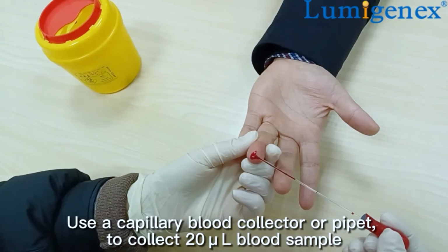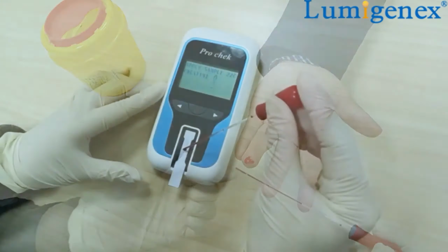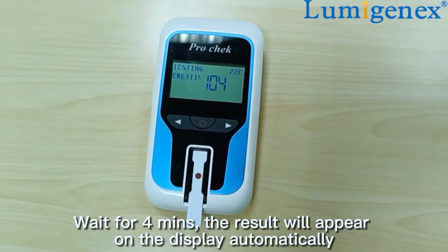Use a capillary blood collector or pipette to collect 20 microliter blood sample. Add the sample into the sample well of the test strip. Wait for 4 minutes. The result will appear on the display automatically.